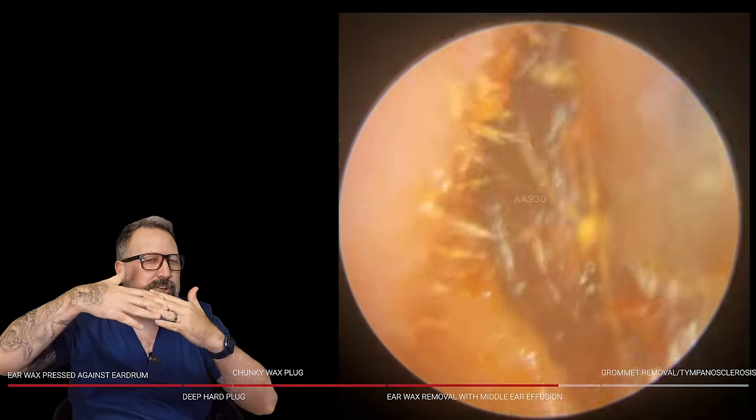Tympanosclerosis is a build-up of calcified deposits in the eardrum itself. Have a look at the eardrum once this last little bit of wax is away — you'll see a lot of tympanosclerosis. Those white patches you can see there — that's tympanosclerosis, really common for children or adults who've had grommets. It can happen with age as part of the aging process. If it's just affecting the eardrum it's called myringosclerosis. It can also affect the middle ear space and ossicles, and less commonly the mastoid bone, but usually it's just the eardrum itself.